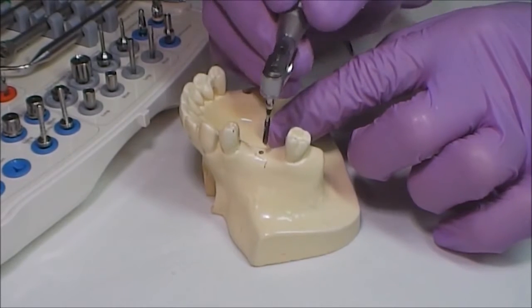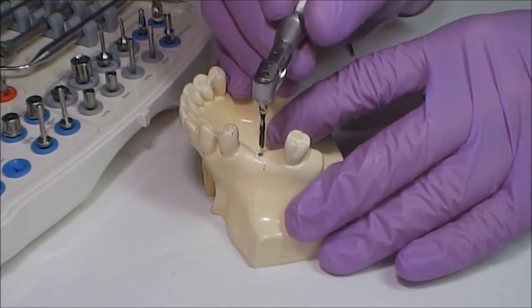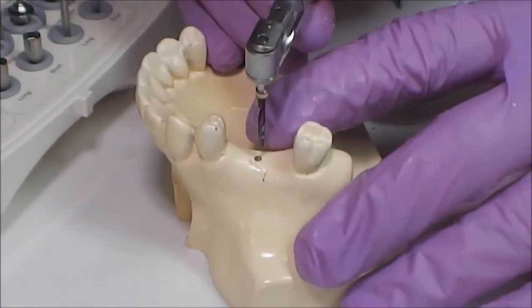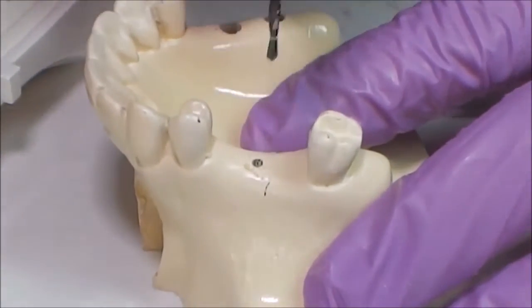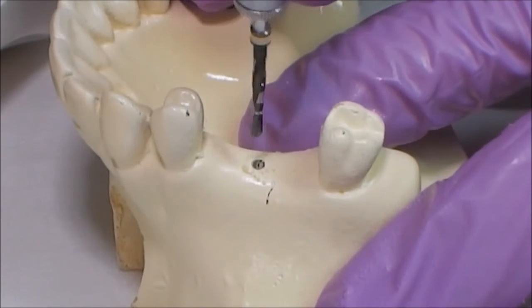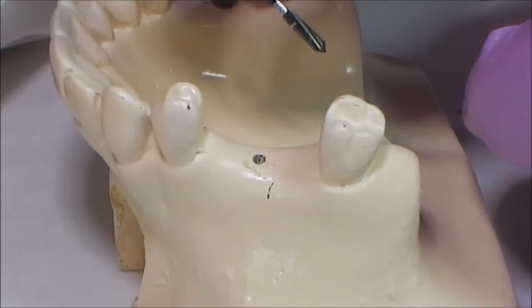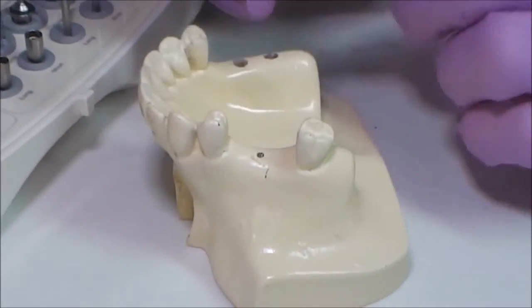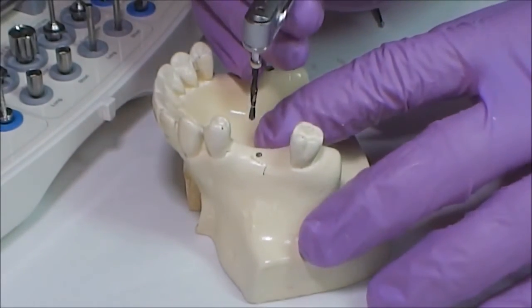It is recommended to perform back-and-forth motions during the drilling to allow cooling of the burr and washing remnants away from its surface, in order to avoid overheating of the alveolar bone and prevent abruption of the implant in future.